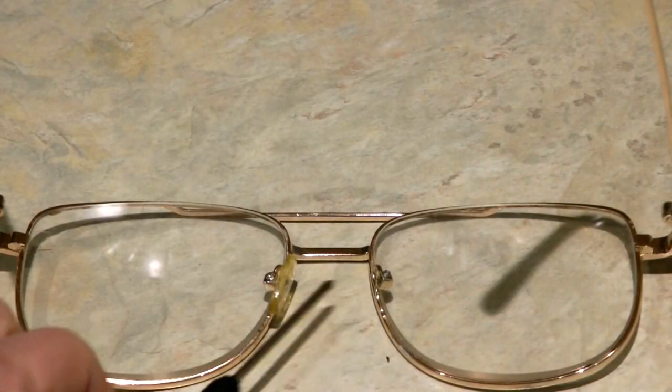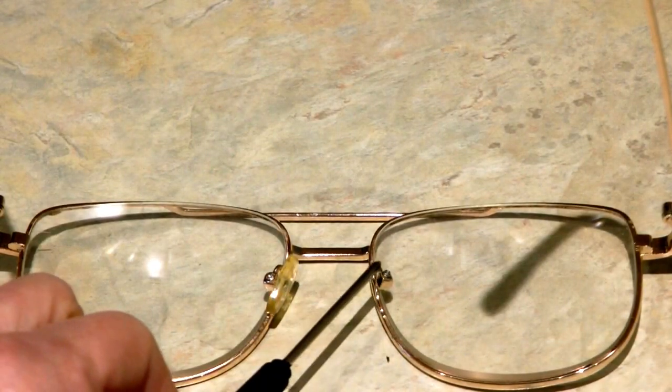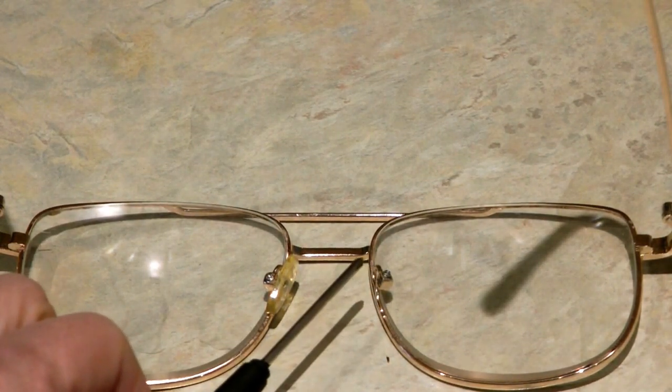Hi, it's AlaskaGranny. If you wear glasses with a metal frame, you may have that little rubbery silicone nose pad that helps your glasses sit comfortably on your face. But those little pads can be damaged or break off, making your glasses very uncomfortable and not fitting your face properly. Here's a very easy way you can replace that little pad and get back to having your glasses fit you and be comfortable the way they should be.